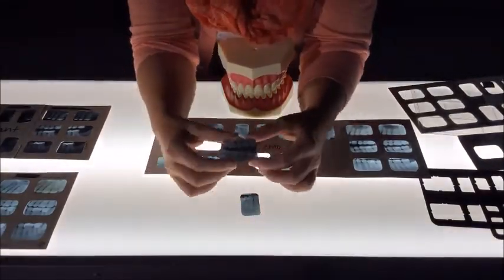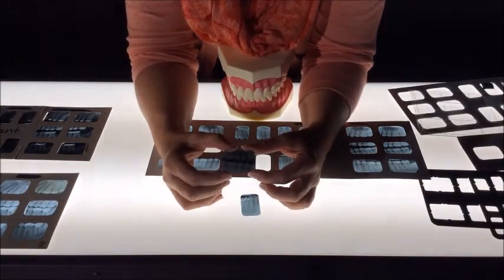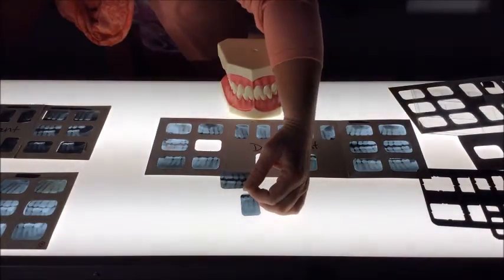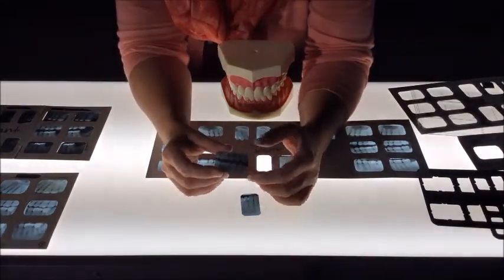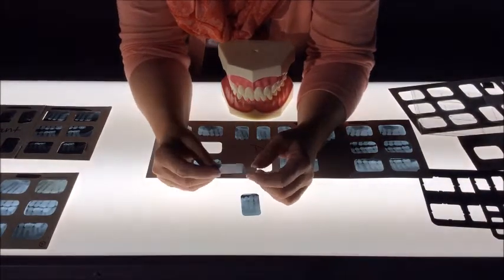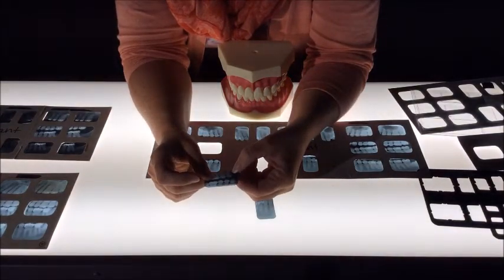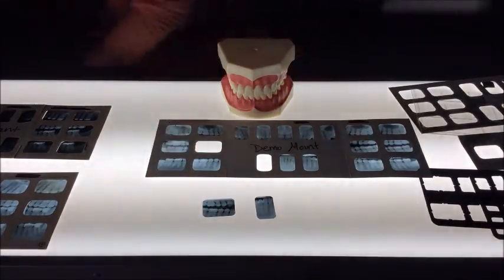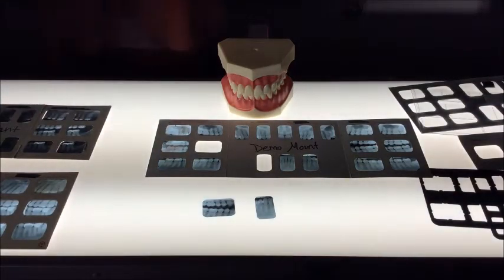But either way, when we look at a film, there's a very important aspect about the film feature that we need to know for film mounting. It's known as the identification dot. This important aspect is usually found at the edge of the intraoral film. It will appear either as a raised dot that appears like a pimple, or if the film is positioned on another side, it will appear as a dimple, or it will appear very concave. This is an important orientation for film mounting because there's two different types of film mounting, and really it's a provider's preference.